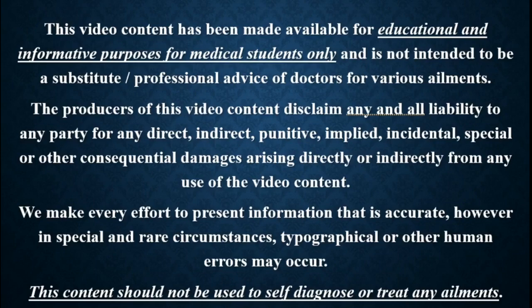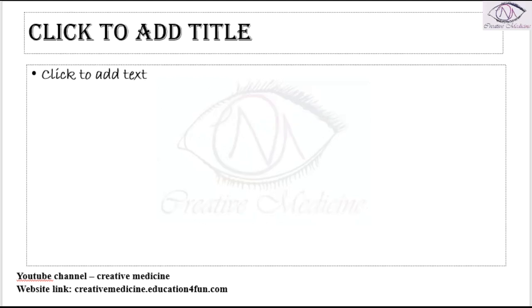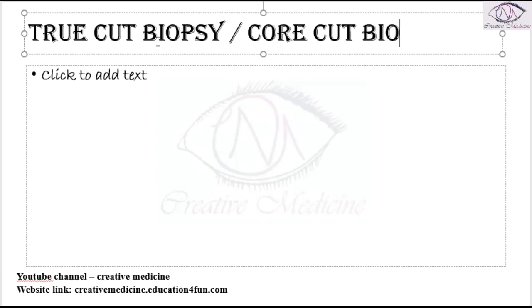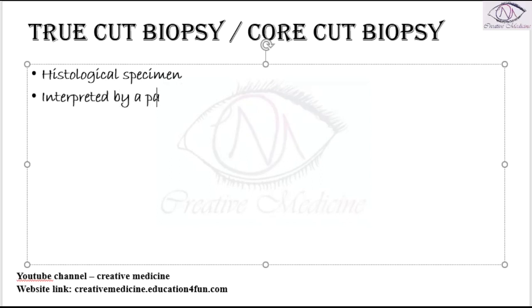In this lecture, we will learn about true cut biopsy, also called core cut biopsy. True cut biopsy or core cut biopsy actually provides a histological specimen, which is interpreted by a pathologist, by any pathologist.